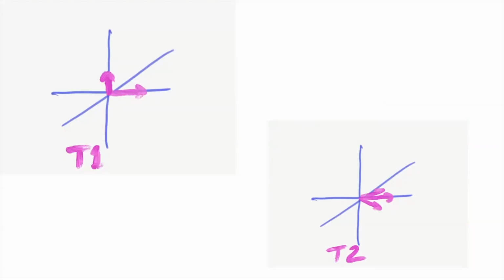These are, in a sense, a representation on this rotating frame of T1 and T2 relaxation time. Remember that T1 relaxation time tells us the time it takes for return to baseline. So as this vector gets shorter, this one will get longer as they recover out of the transverse frame back into their baseline state. And so that time is described as the T1 relaxation time. Or in fact, the T1 time is about 2/3 of recovery from this excited state.